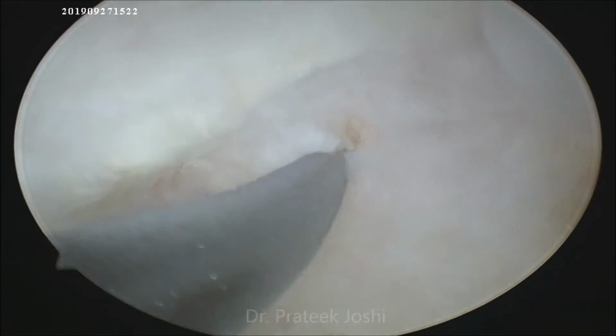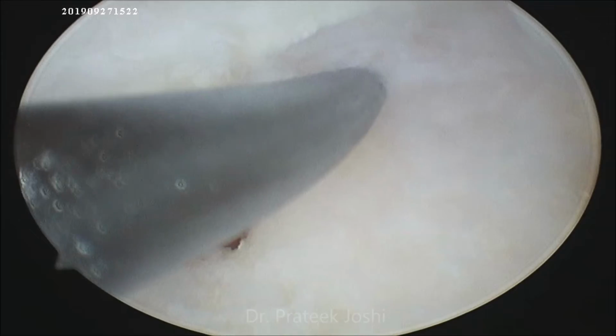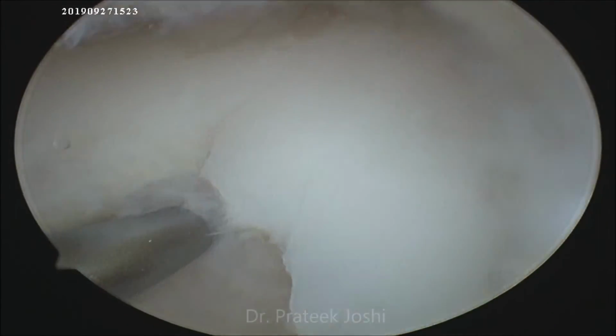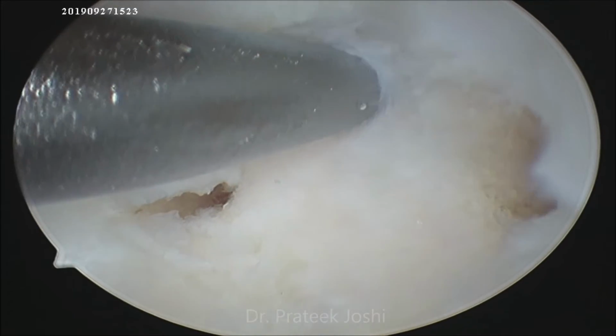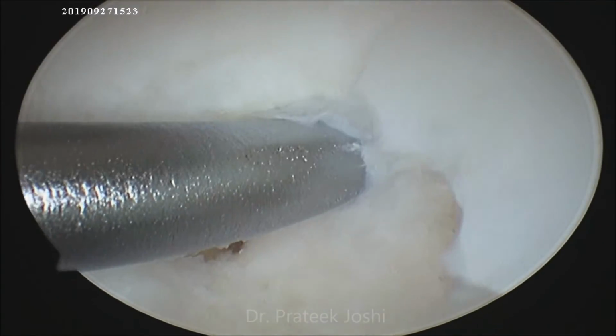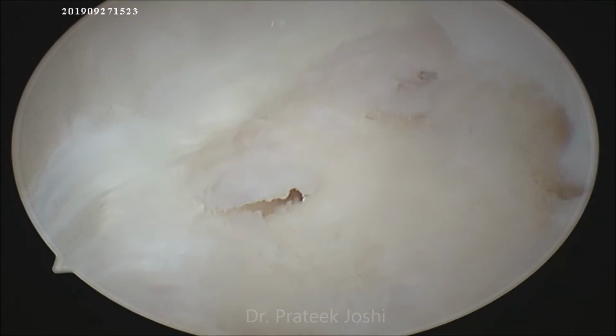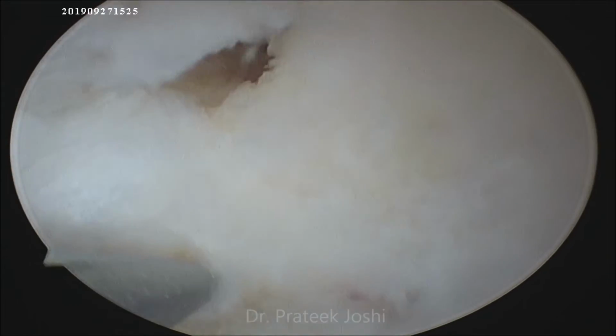While preparing the bed of the defect, the calcified cartilage layer must be removed, but the abrasion of the subchondral bone must be avoided. A 1 to 2 mm bridge of bone must be left between the penetrations to allow connective tissue to fill the defect and adhere to the base of the defect.